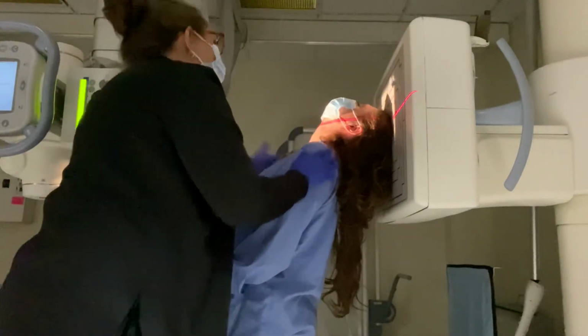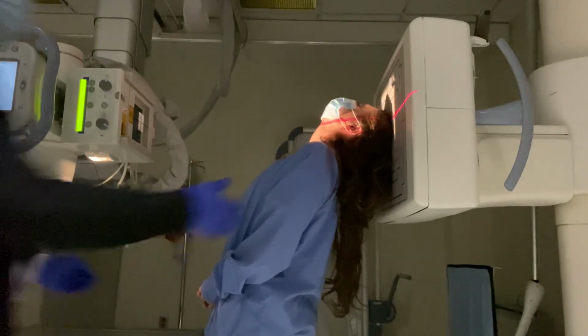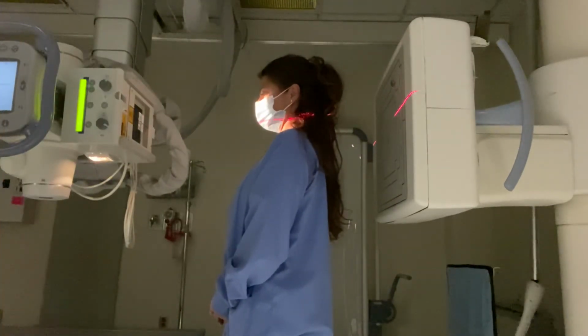This is really difficult for your patient to hold, so you want to make sure that you're hurrying. So I have my patient hold nice and still just like that, and then when they're done, you can just help them right up. So that's it for the skull for this week.